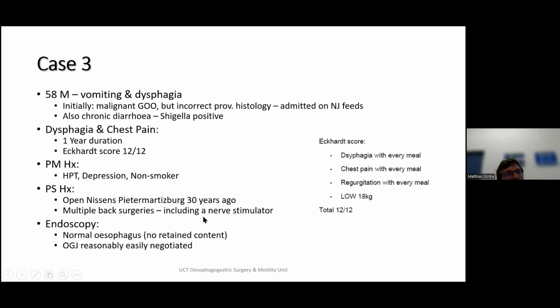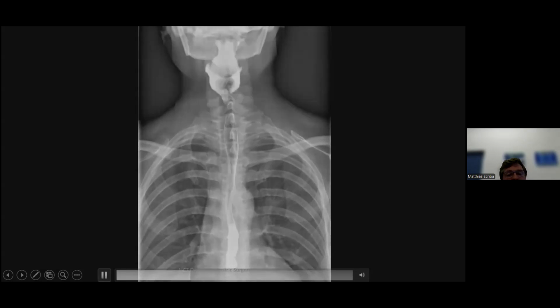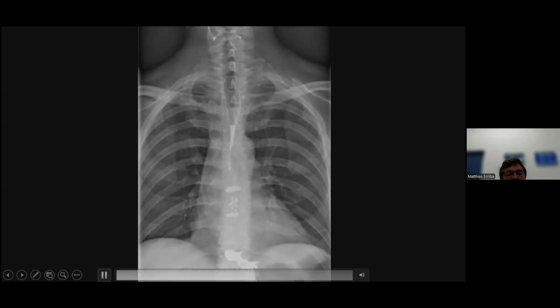I mentioned this because it obscures the barium swallow I'm going to show you now. And on the endoscopy, which we did here, the esophagus was actually reported as normal. The OG junction was quite reasonably easily negotiated, and we had that ulcer in the stomach. Now, the barium swallow, which follows here, you can see, looks very abnormal.